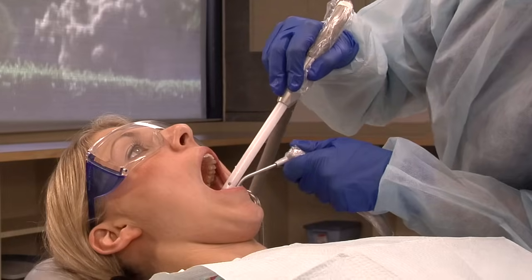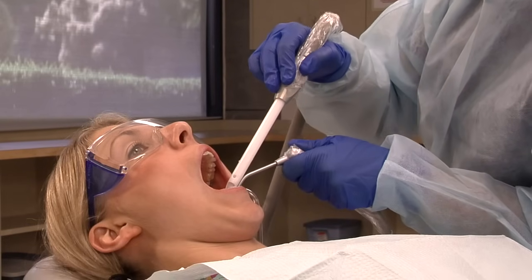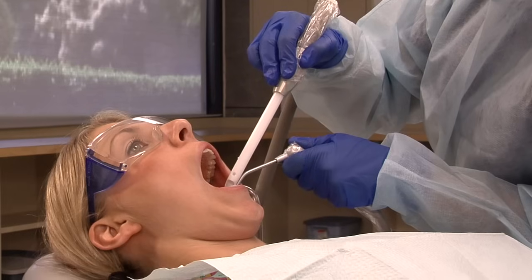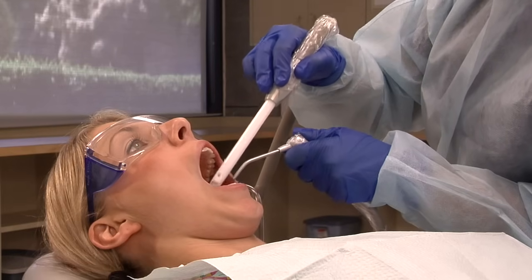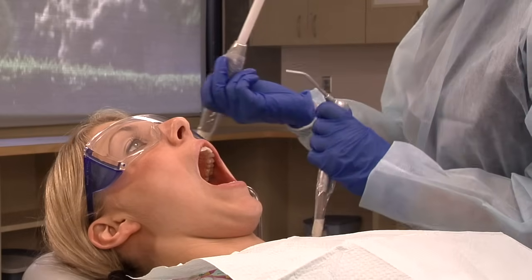Also be careful to avoid resting the suction tip on the patient's gum tissue or lips during a procedure. Be aware of where your suction tip is located at all times, as this can cause the patient great discomfort.